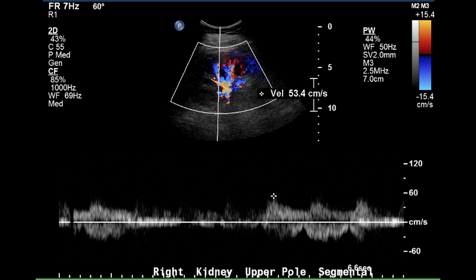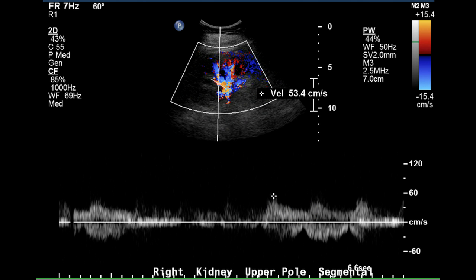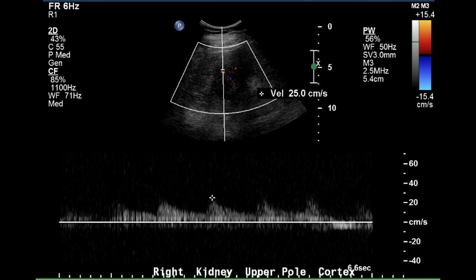There is low resistance flow in the upper pole segmental artery. The resistive index was not calculated because the diastolic velocity wasn't determined, but it is approximately half of the peak systolic, which is a normal relationship. The same is true in the upper pole cortex of the right kidney. This is likely an arcuate artery, again with sharp upstroke and continuous flow.